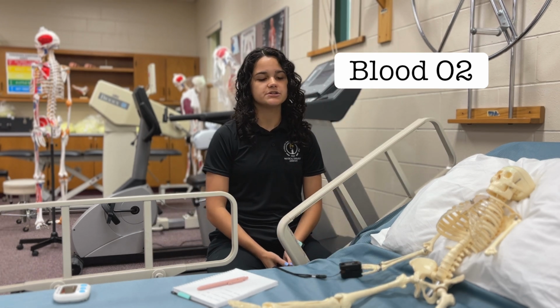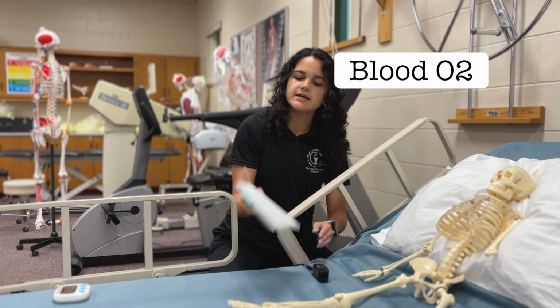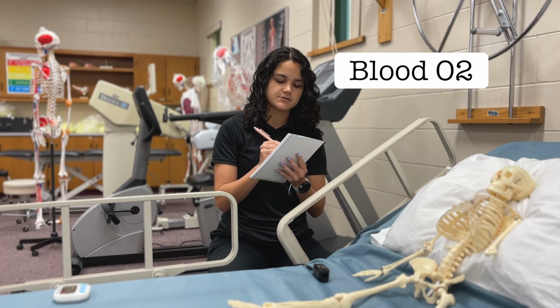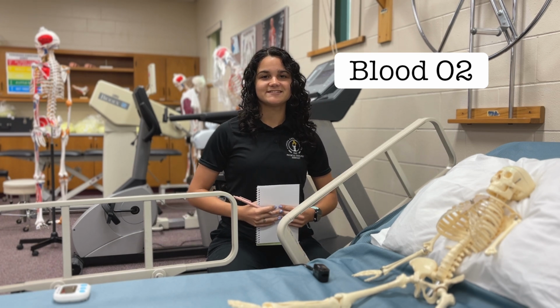and just waiting patiently. Great. And Mr. Skella reads 0%. Nice. On to respirations.